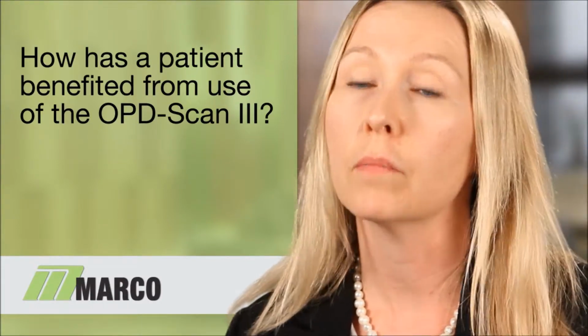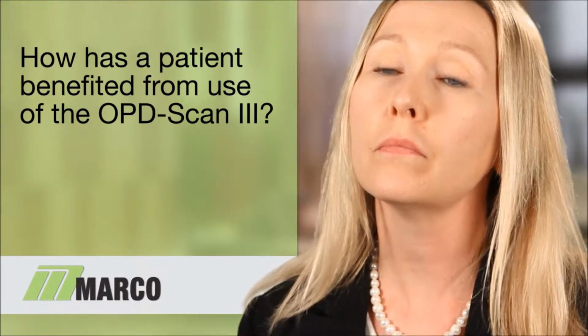He was a good candidate. That was the case at 1 week postoperatively as well. And then we looked at the OPD, and the nice thing about OPD is that it really splits your aberrations into the cornea and the posterior segment, the internal OPD. And this is where it becomes really important. It is truly an aberrometer of the entire eye.